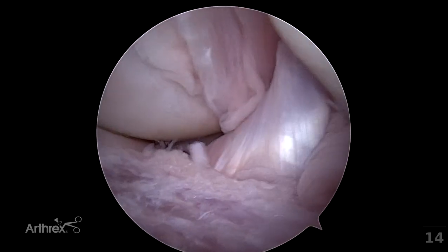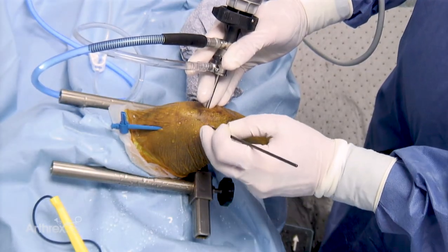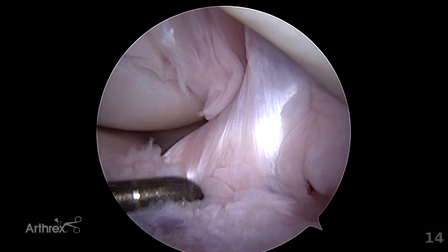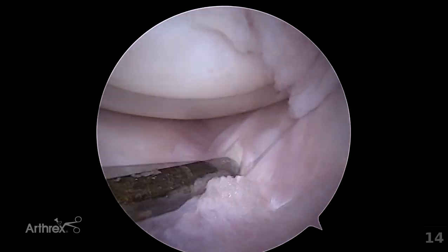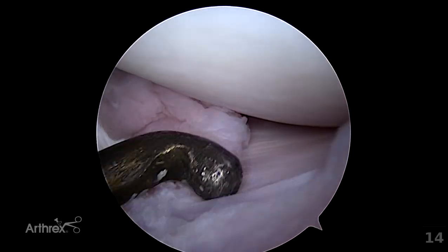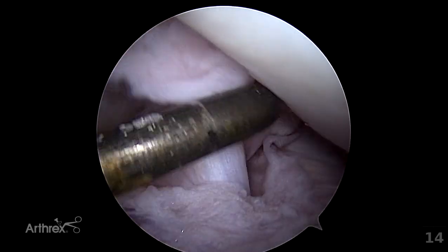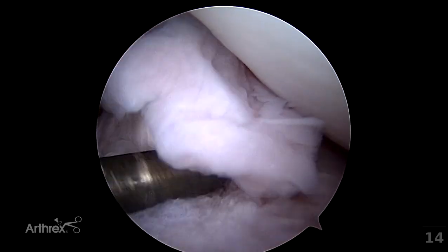Further fine-tuning of focus is recommended. At this stage, assessment of the intra-articular structures is performed. A right-angled probe with measurement capability can be used. The 2.5mm joint probe with gradated measurements is being placed into the joint. The cranial cruciate ligament can be seen in this position. The inter-meniscal ligament will sit directly cranial to it and wrap around the insertion point of the cranial cruciate. To our left is the medial joint compartment and the cranial aspect of the medial meniscus. To our right is the cranial aspect of the lateral meniscus and the lateral joint compartment. Tensioning of these structures will allow assessment of pathology, stability, and laxity.